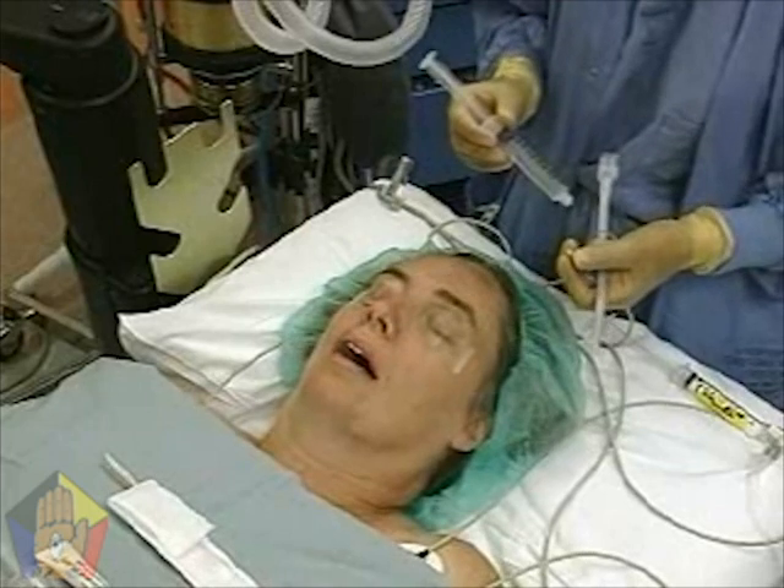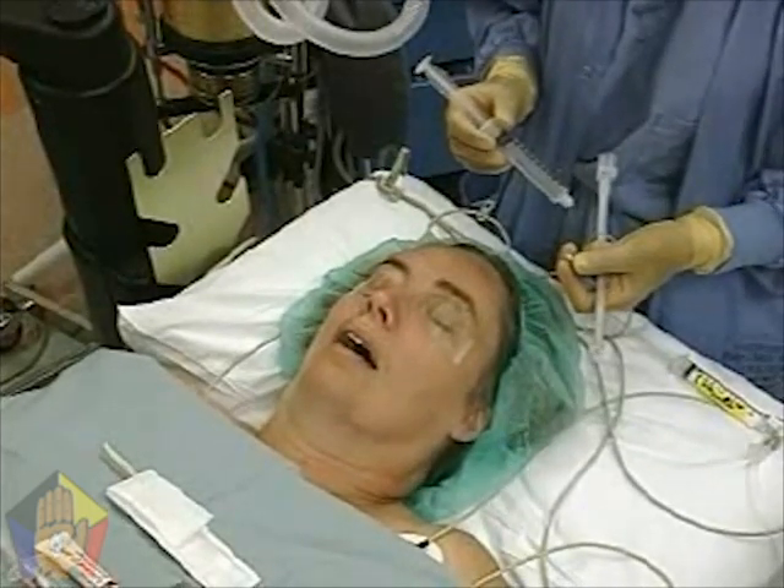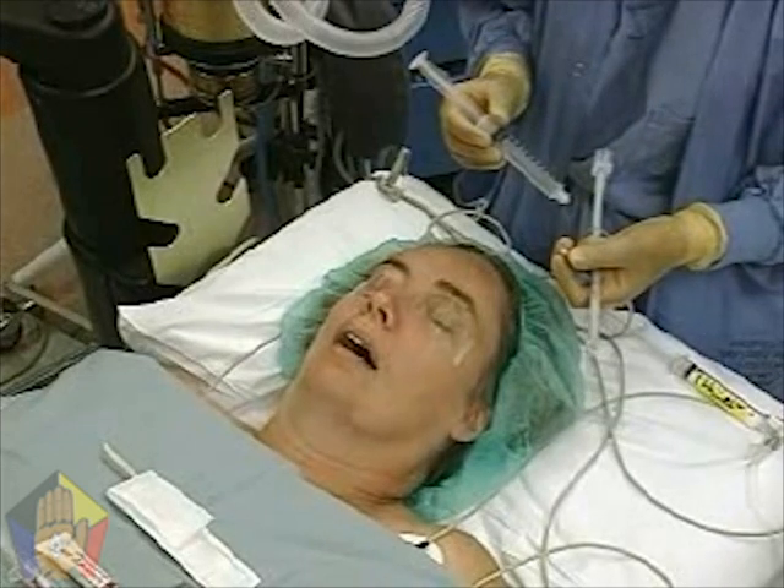Nasal intubation is generally done in the awake, spontaneously breathing patient when there is an advantage to avoiding laryngoscopy, such as with a cervical neck fracture.